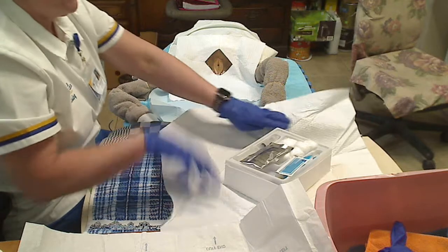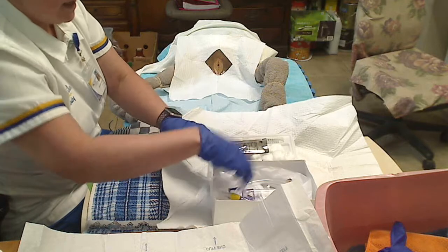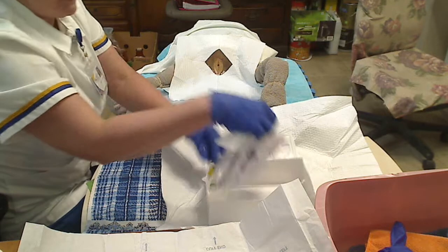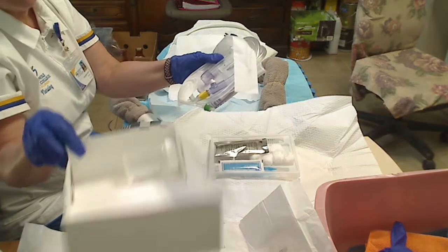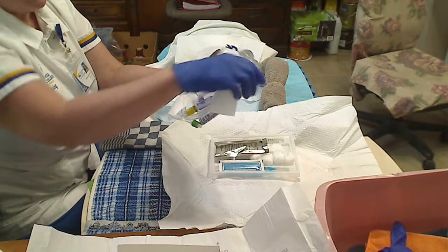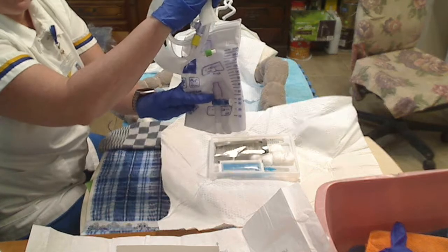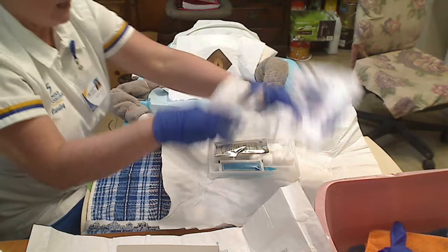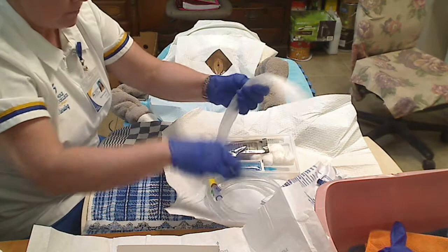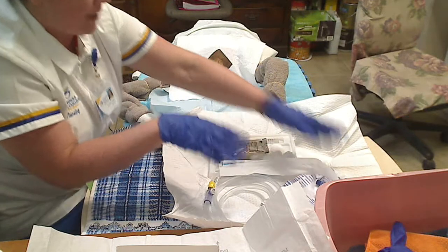Okay. So I'm going to organize my kit. I'm going to pull my catheter out. I am going to dispose of the box. I am going to open my catheter while I am here and make sure that the clamp is in the closed position so that I do not forget. I am going to open it and lie it down within my drape.